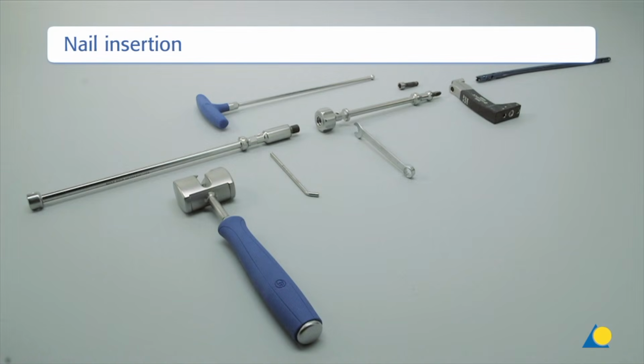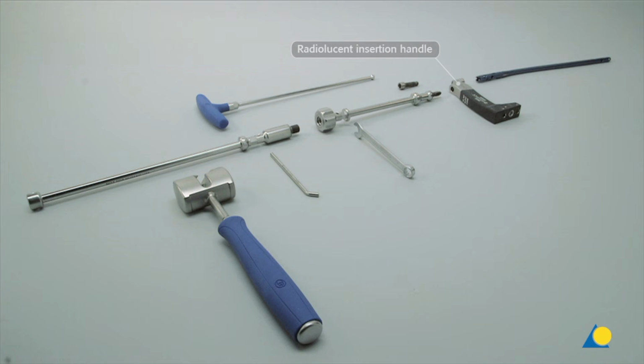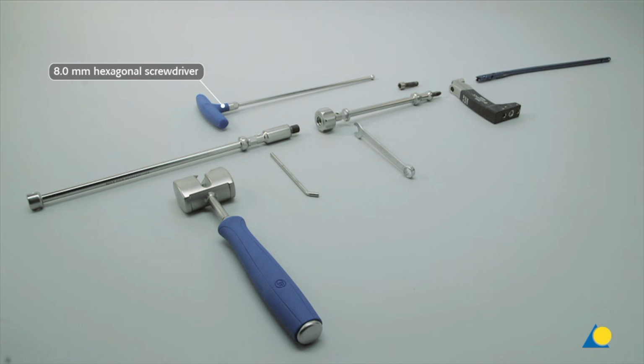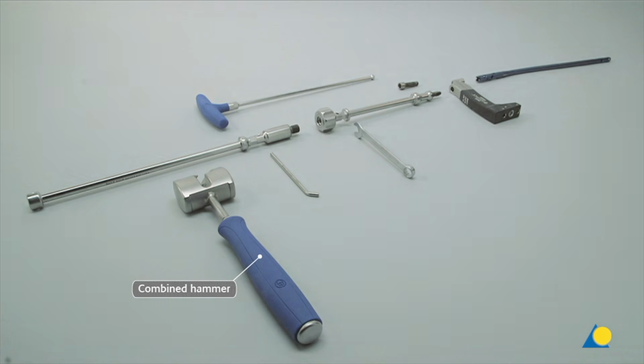The instruments used to insert the nail include the radiolucent insertion handle, the connecting screw, cannulated, short, the screwdriver, hexagonal, 8.0 mm diameter with spherical head and T-handle, the driving cap with thread, the combination wrench, 11 mm diameter, the hammer guide, the pin wrench, 4.5 mm diameter, and the combined hammer.